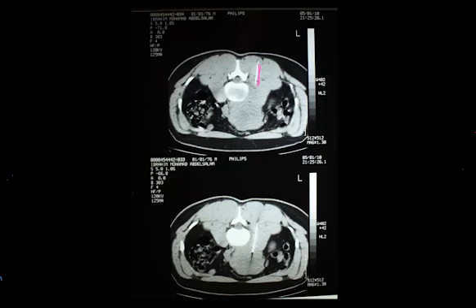I wouldn't have thought it was needed, honestly. I don't think it was needed, but this is what happened. They were biopsying it. It looks really malignant and very ugly. But anyway, they biopsied it, and we used the image just to remind you that you can very well biopsy a lesion guided by CT. So it's a needle biopsy, obviously.